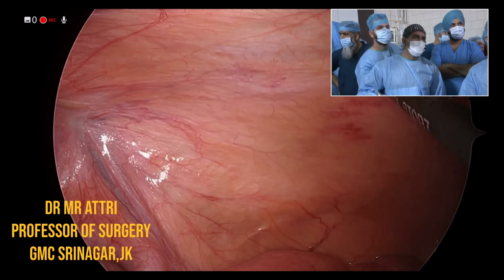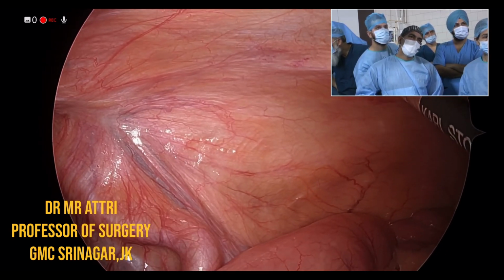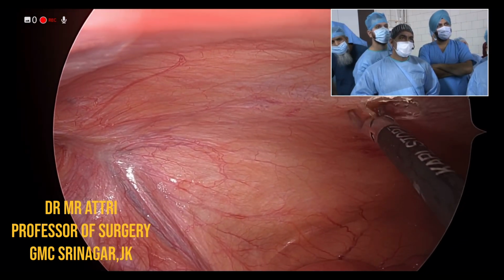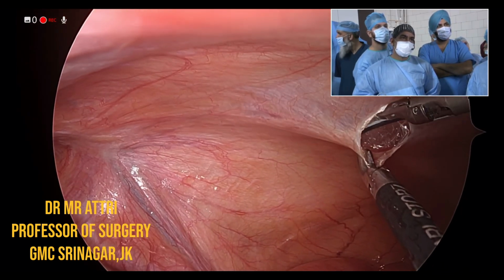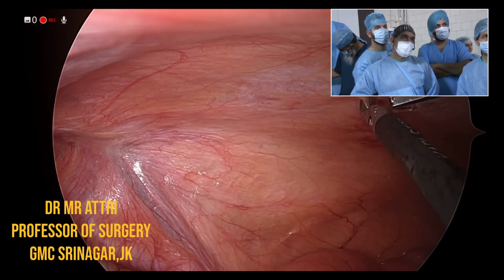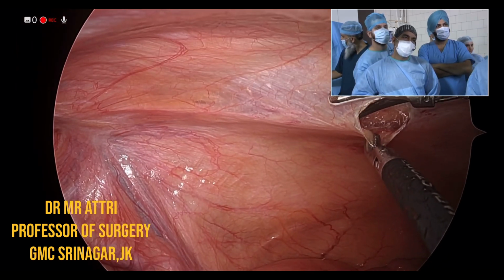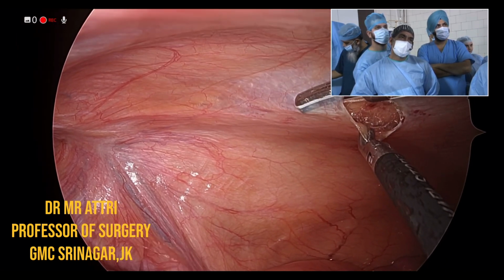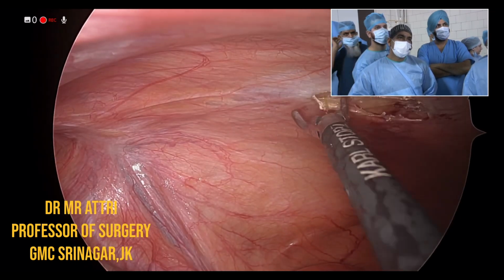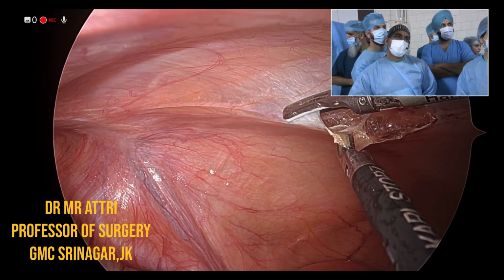Incision should be almost 2 centimeters anterior superior to the iliac spine. We'll be giving a horizontal incision. Normally we can use scissors, but as I have given the incision, the CO2 pushes in and the peritoneum is lifted, so this helps us in our dissection. So we will be giving a horizontal incision to the peritoneum at least 4 to 6 centimeters up to the medial umbilical ligament.